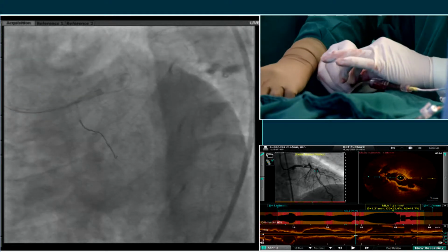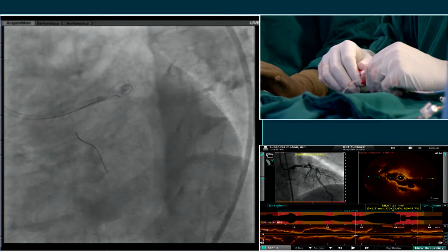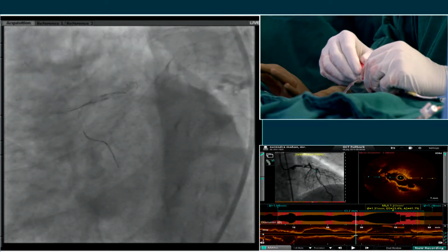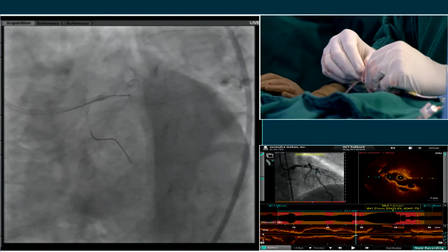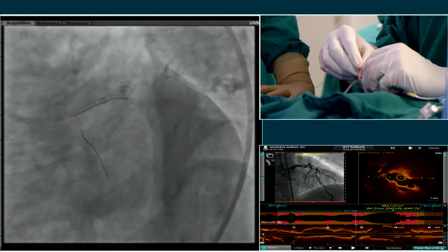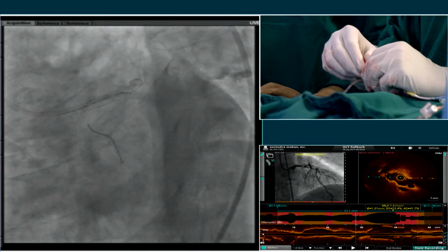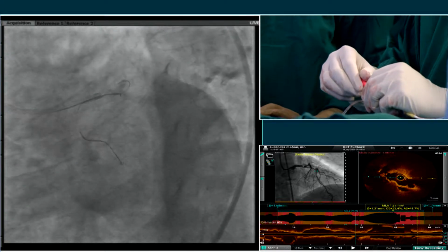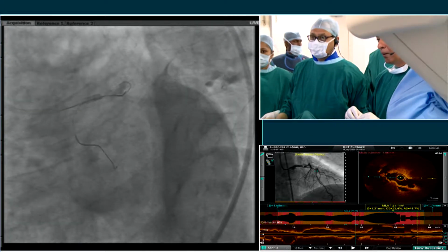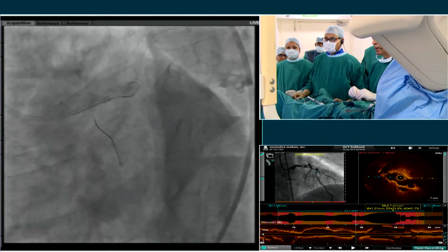Another thing to talk about that we didn't before is whether the patient needs any type of hemodynamic support with an occluded right, occluded large OM, tight left main. The good news is the EF is fine. The MR question was also relevant as well. And his blood pressure starting off, at least we could see on the screen, looked great. So typically these cases can be done without support, but if there are any issues, then you have to.